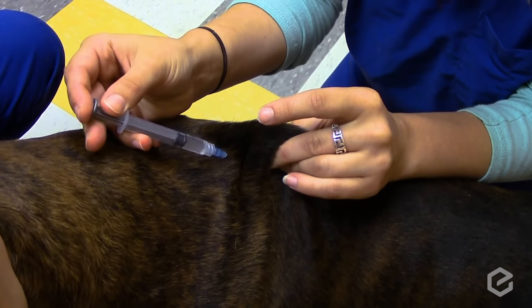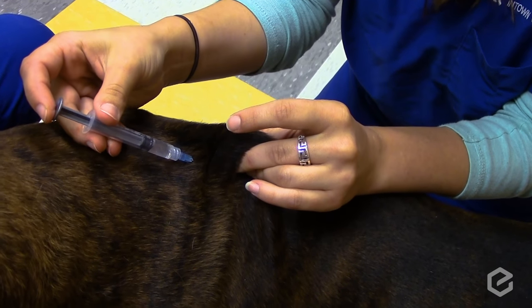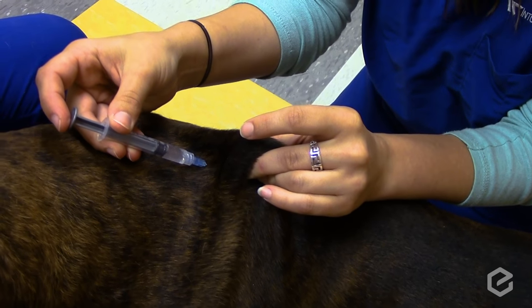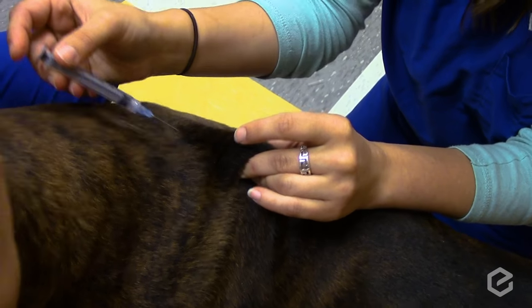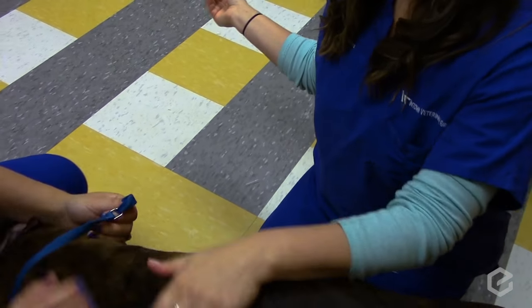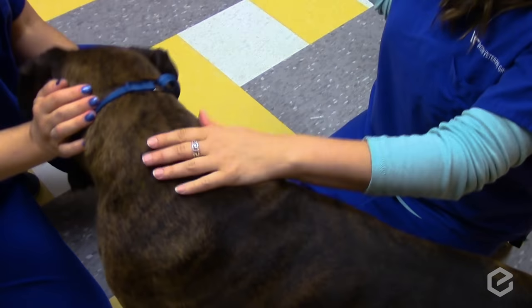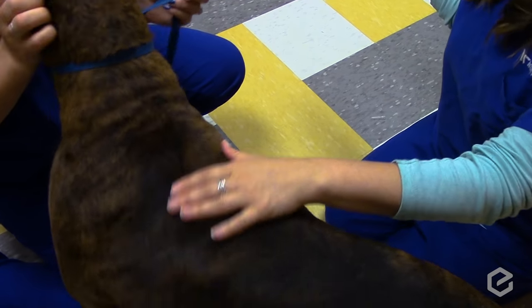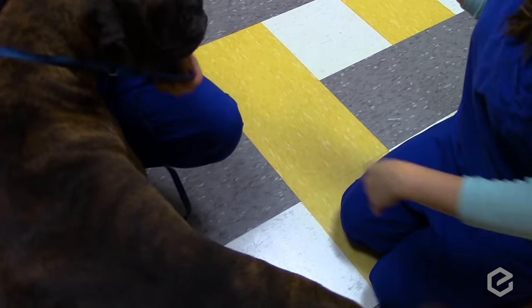Pull back on the plunger and make sure there's no blood or air, because if you suck in a lot of air, you may have poked through and through. Then go ahead and inject and come out. I always give my pet a little rub where I've injected, just to make sure I didn't squirt the medication onto their skin — if it's wet, they didn't get the medication. Give them lots of praise.